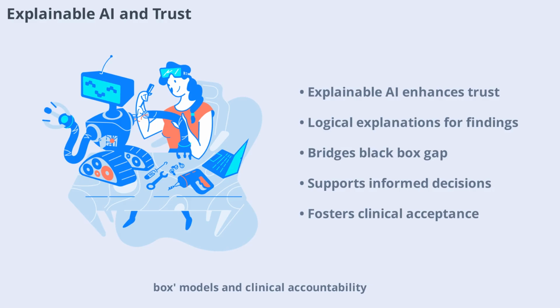Explainable AI, XAI, enhances trust among practitioners, enabling clinicians to understand and verify diagnostic outputs. Heat maps and transparent reasoning will support informed decision-making and foster acceptance of AI in clinical workflows.